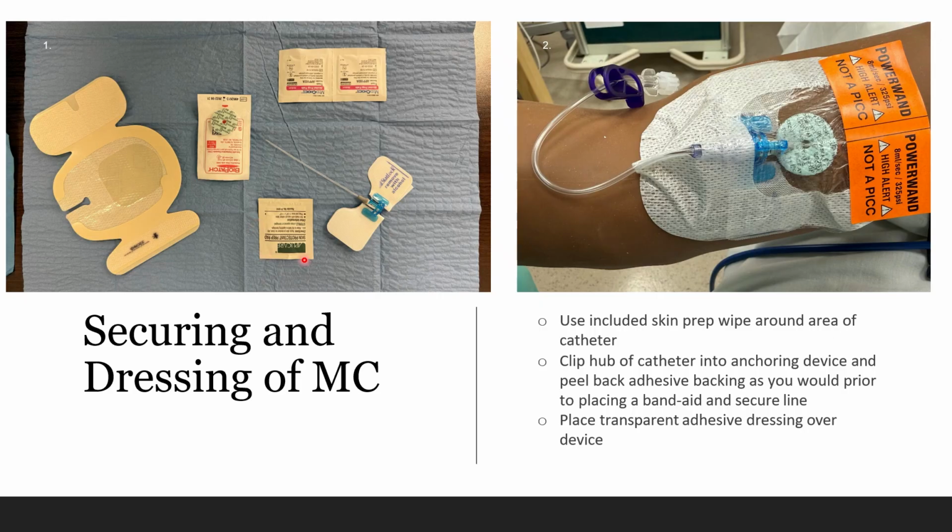If you ever painted something, you put that on the skin and it helps the adhesive grasp the skin a lot better, especially when you put that Tegaderm down, because if you haven't got all that gel and everything up, you want to clean up with alcohol, do a wide swath over this arm so that when you go to secure this device, it will stick really well. When you put the Tegaderm on top of it, that will also adhere very nicely to the skin.